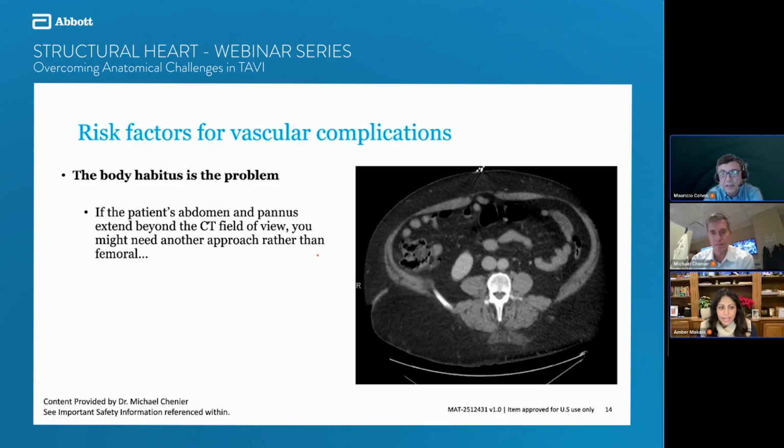Yeah, so I was actually going to pose the question to the team, similar to what you asked. In the past, we were fairly quick to think about calcium modification in femoral and iliac arteries that were heavily calcified. I think we've gotten so savvy and can do alternative access approaches with such finesse that even those skills seem to be a little more in the rearview mirror, much like the other access points you had suggested.